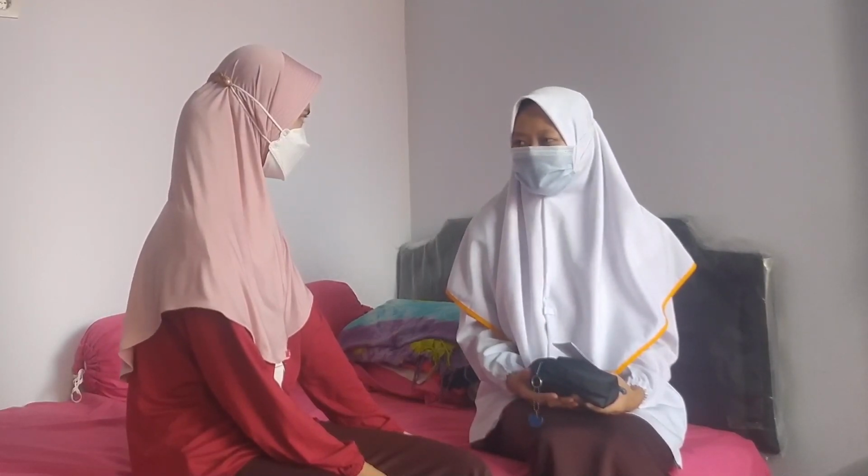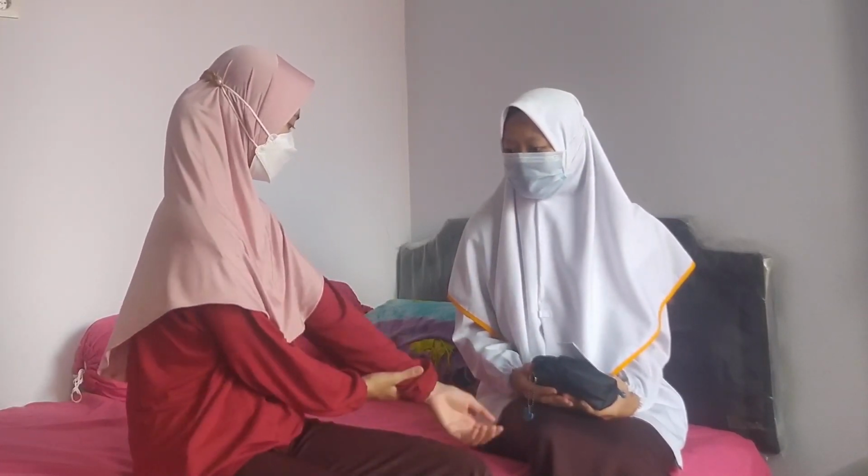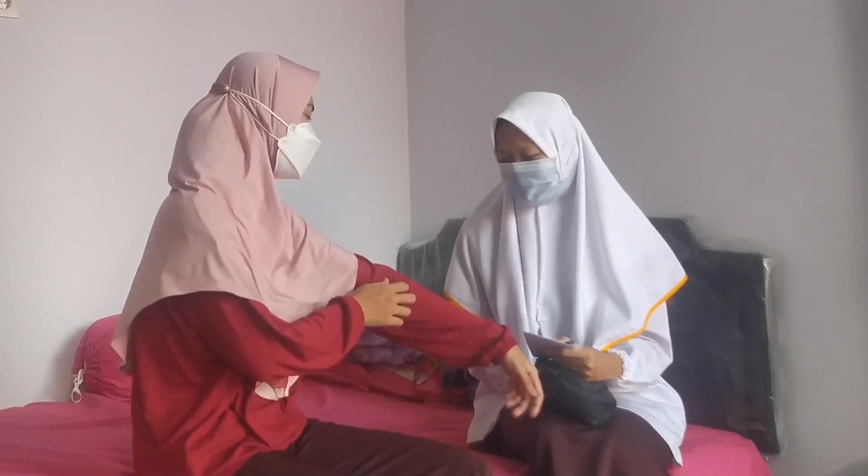Morning, Mrs. Farah. How are you doing today? Morning, I'm feeling good. Okay, Mrs. Farah, I just want to measure your blood pressure. Do you mind? No, I don't. The procedure, I am going to put this cuff around your upper arm later. Okay, nurse. Would you mind using your right hand? Yes. Okay. Please roll your sleeve up.